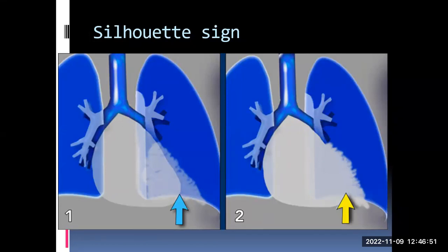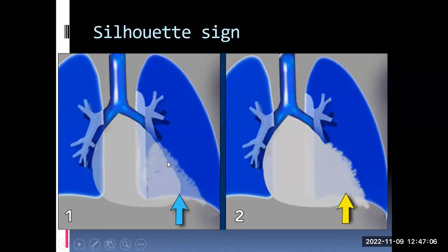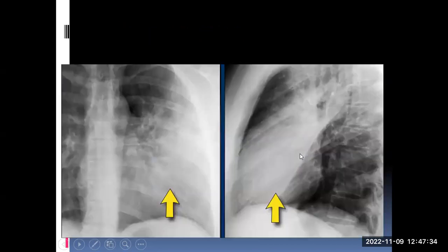If you look at an image and see shadows in the lungs, in the lower zone of the left lung, superimposed on the heart shadow but you can still see the heart shadow through it — this is not silhouetting. We say the silhouette is not positive. But if you come to another image and you see shagginess with the heart border not visualized, that is a positive silhouette sign.